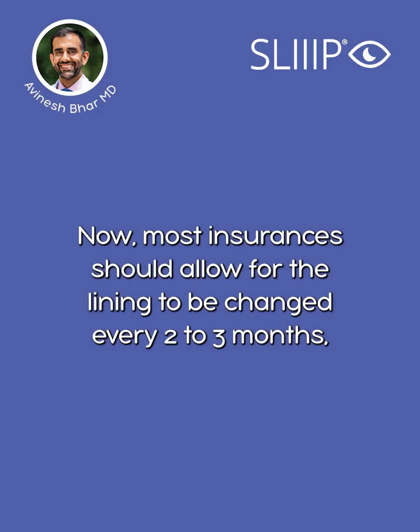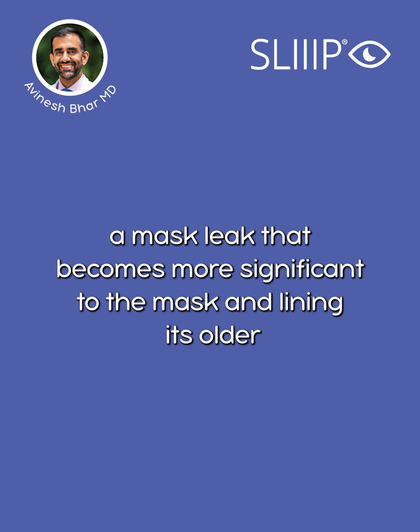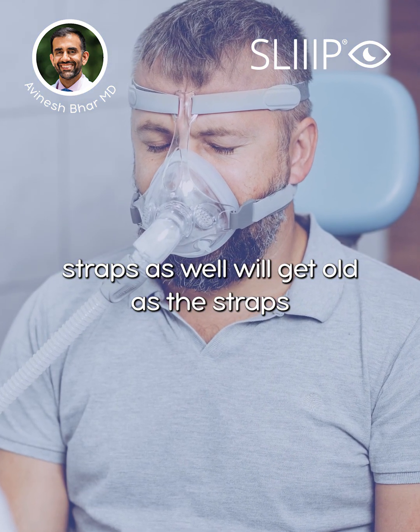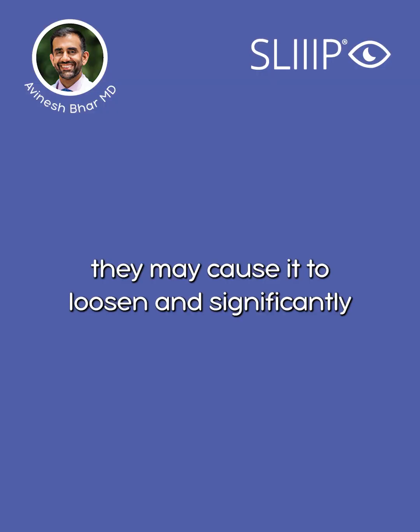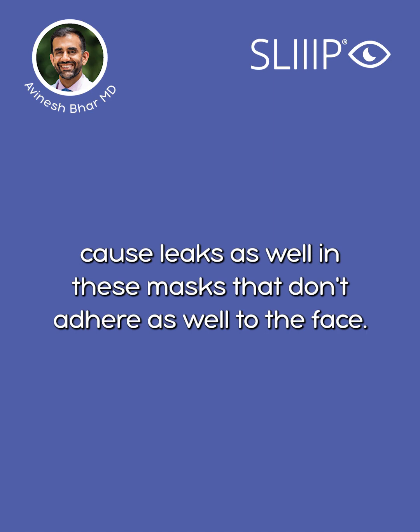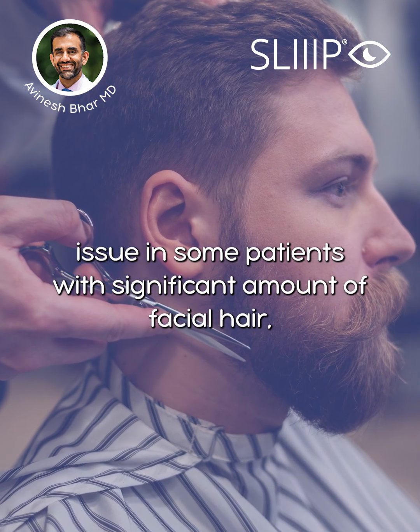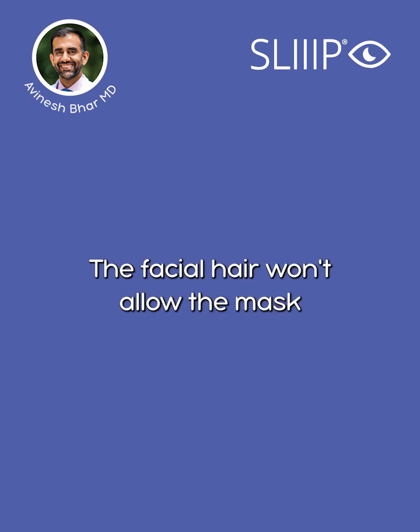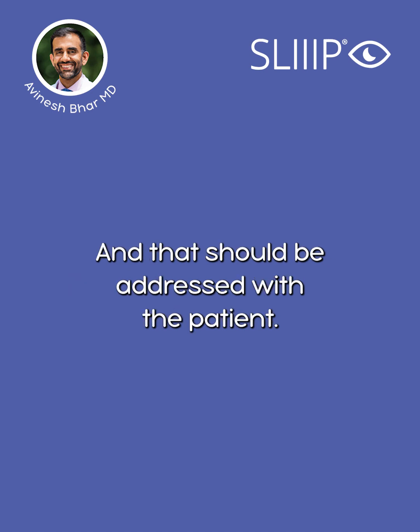Now, most insurances should allow for the lining to be changed every 2 to 3 months, and this should be kept up to, especially if the patient experiences mask leak that becomes more significant as the mask and lining get older. Straps will get older as well, and because of tightening of the straps over a period of a few months, they may loosen and significantly cause leaks in these masks that don't adhere as well to the face. Facial hair is an issue in some patients with a significant amount of facial hair, or as they grow facial hair as they use the mask. The facial hair won't allow the mask to adhere as well to the face, causing significant air leaks, and that should be addressed with the patient.